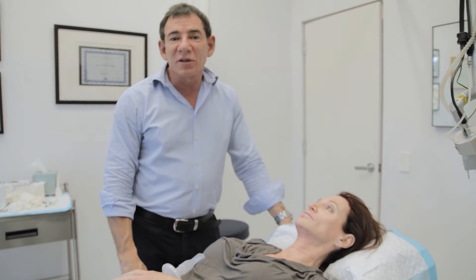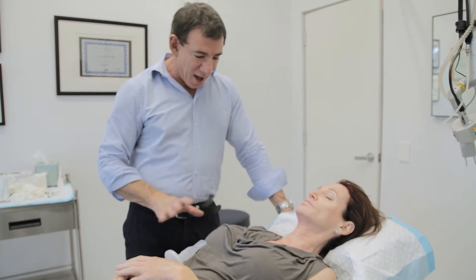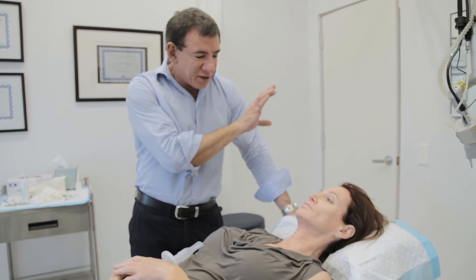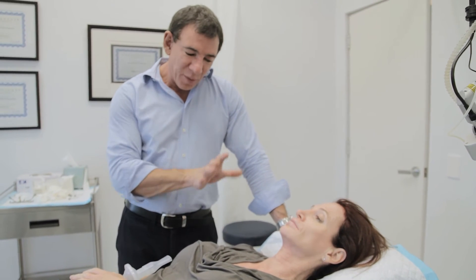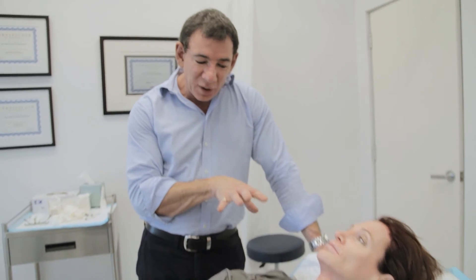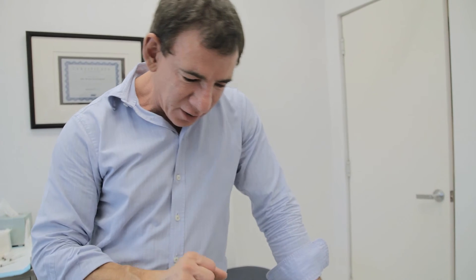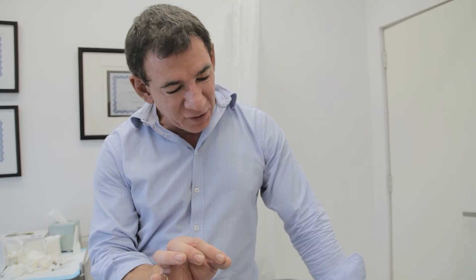So today we've done quite a few things on Kate. We've done a complete PRP rejuvenation of her neck and chest, laser and PRP rejuvenation of her hands, hair thickening and restoration treatment on her scalp, and lip rejuvenation. From the point of view of the neck and chest — that's purely platelet-rich plasma — that will soak in. She's got very few bruises there; most of that redness and mottling will be gone in one to two days. The results will start within about 10 days to two weeks.